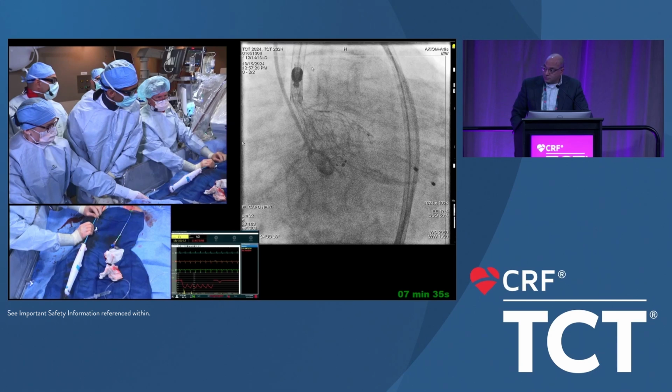But you can continue. The question that I have for you, both guys, is the speed of deployment. How slow do you go? Because per experience, the larger the valve is, the more time it requires to deploy to make sure that you release the entire energy in a very stable and steady way. Is it something that you have experienced as well with the Vision 35, going slower and slower just to make sure that you control everything?